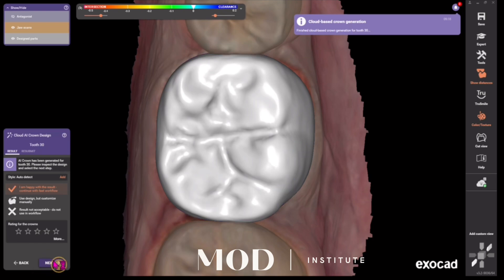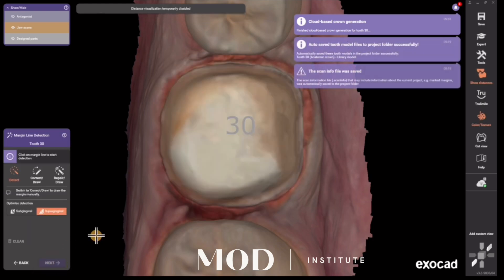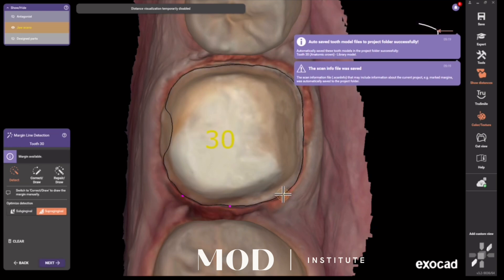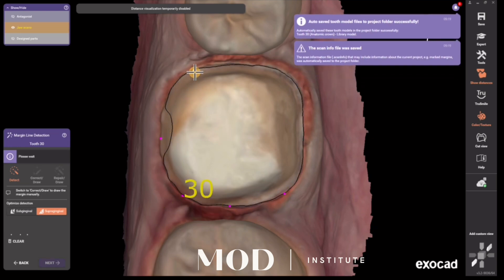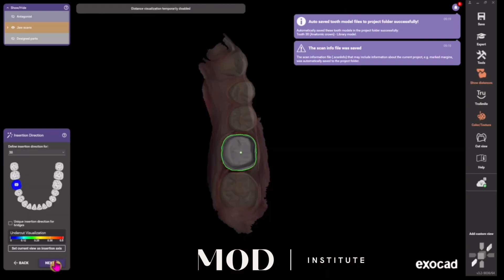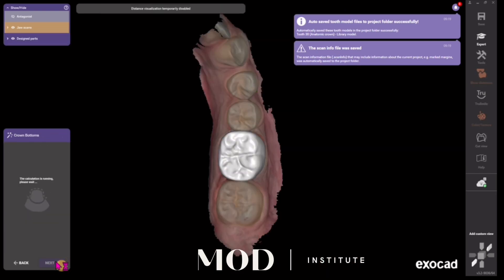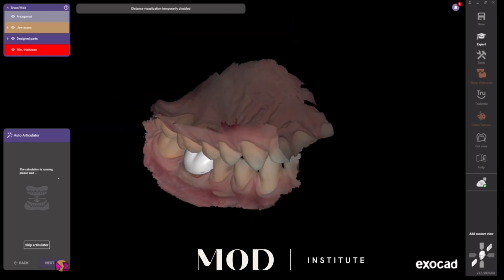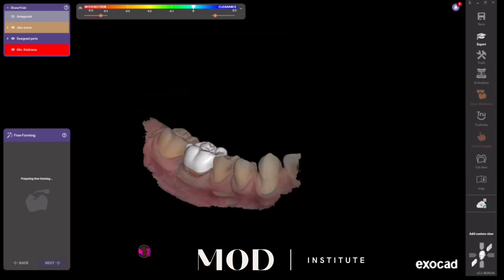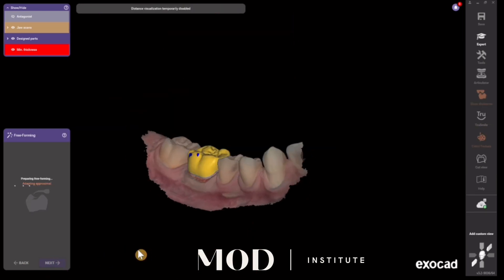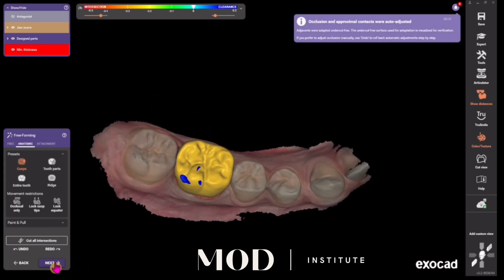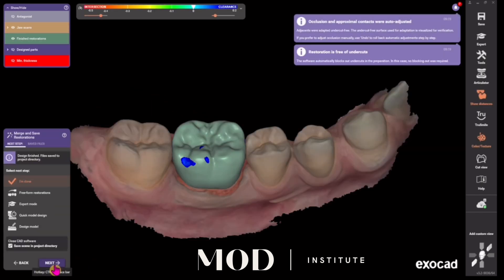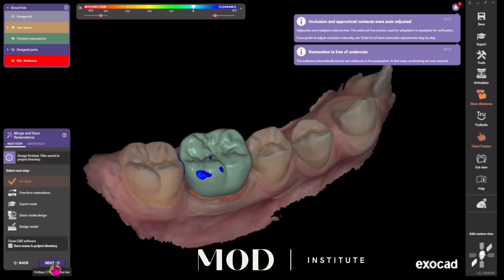When you hit Next it brings you to the Margin tab and asks you to either verify or mark your margin. Here I'm marking my margin — hit Next — and now it's going to automatically adapt the tooth, go through dynamic articulation, fuse down to the margin, and auto-cut the occlusion.